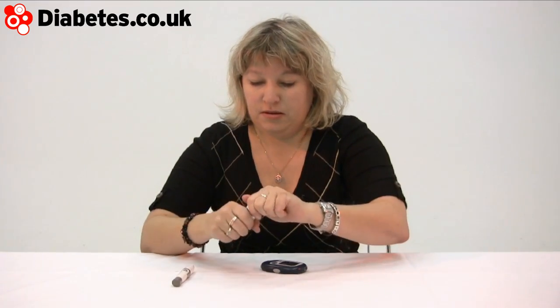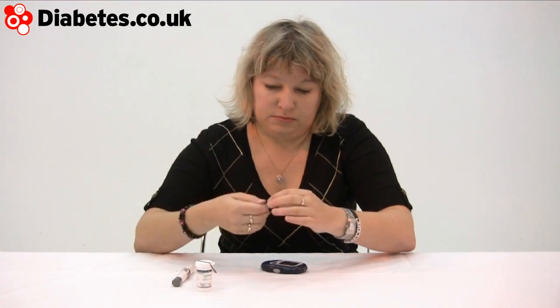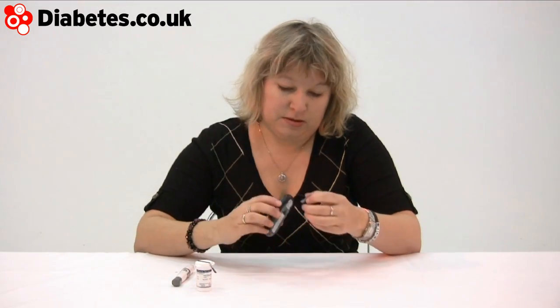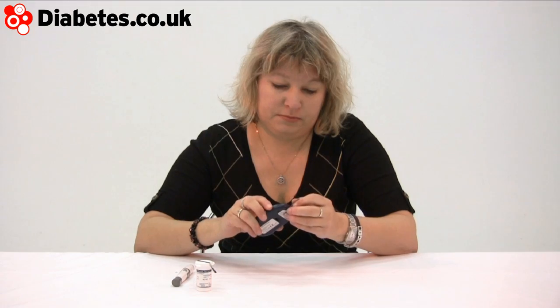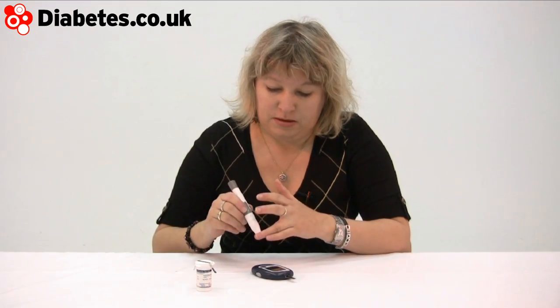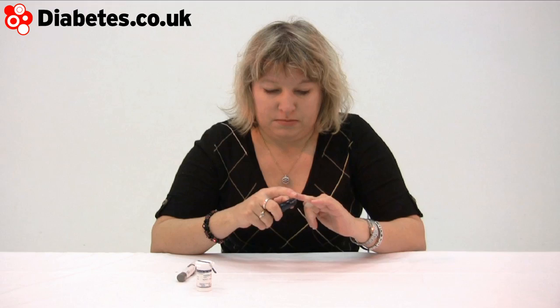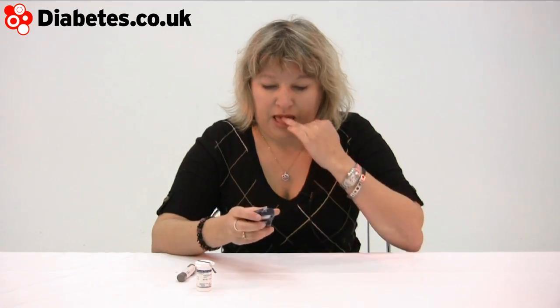Let me just get a strip out and get it popped in ready — that turns it on automatically. I'll do a little blood test. And off it goes. Just five seconds to count down.